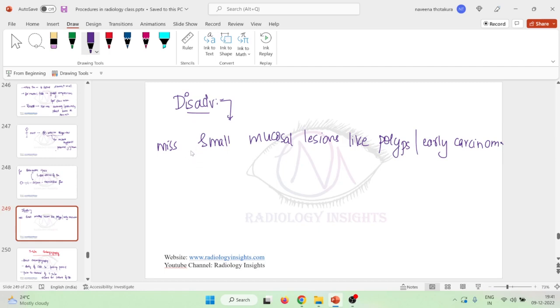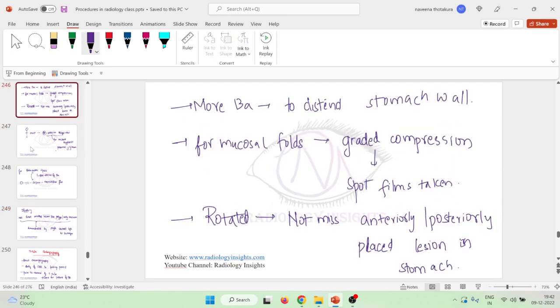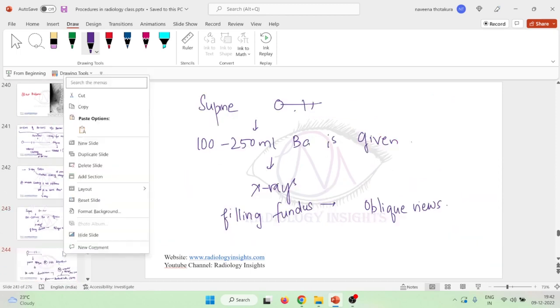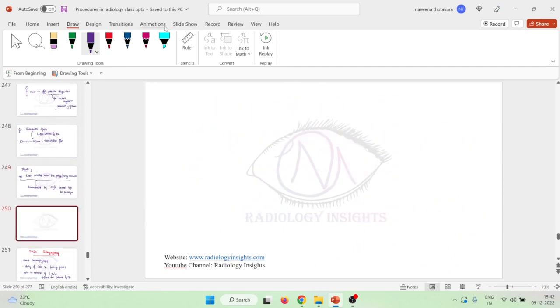But one important point is that these small mucosal lesions and polyps can be demonstrated, or can be seen, by using a single contrast, definitely also single contrast, but using a high kilovolts technique. By using single contrast high kilovolts technique, we will not miss these lesions. Actually, the normal conventional single contrast study is done at 80 to 90 kilovolts. But if the same is done at high kV, that is high kilovolts, then we will not miss these small mucosal lesions also. So let us learn some important points about single contrast high kV technique.